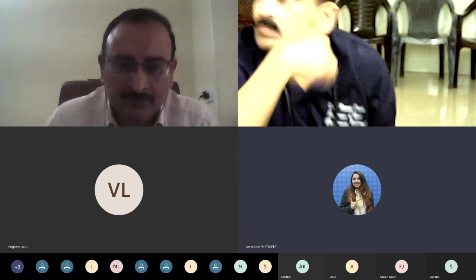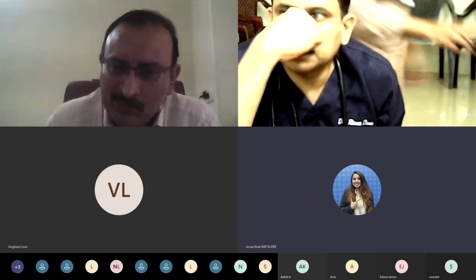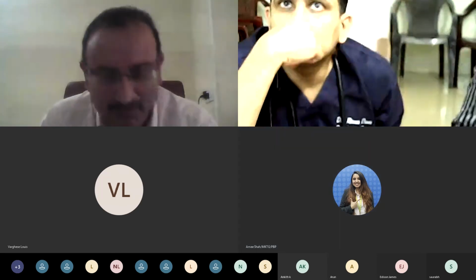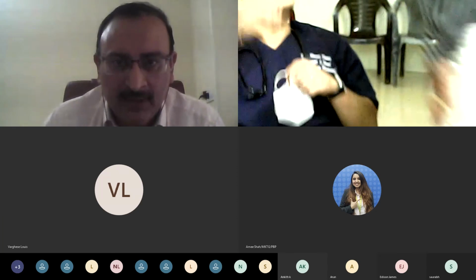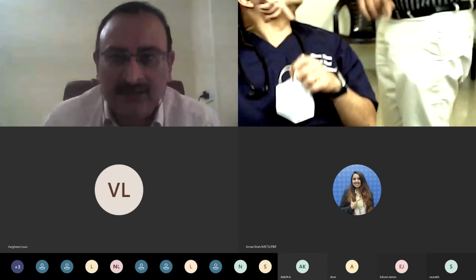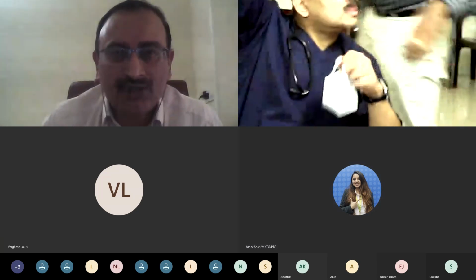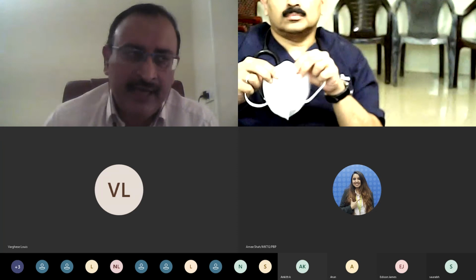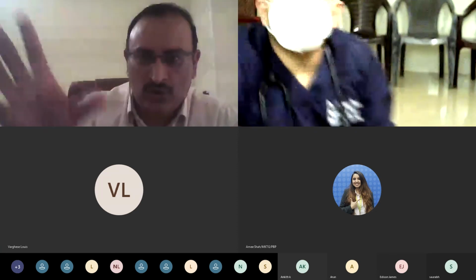Dr. Mohammed Kuti is asking, sir, what is the ideal PEEP to start with? Yeah, again, I was telling about that. My ideal PEEP, in the ICU, will be around 5. Okay, and then I'll think about it. So where do I think about it? If the patient's oxygenation is an issue, then I will, again, somebody is going to talk about PEEP. So I think there is one full topic on PEEP.